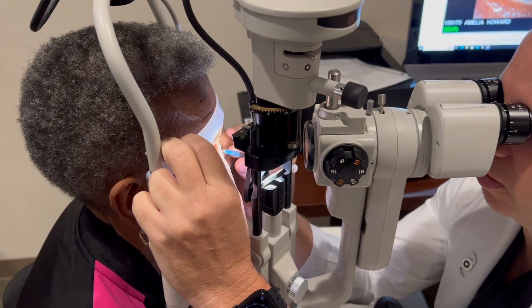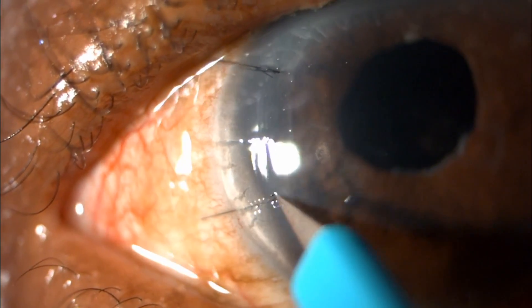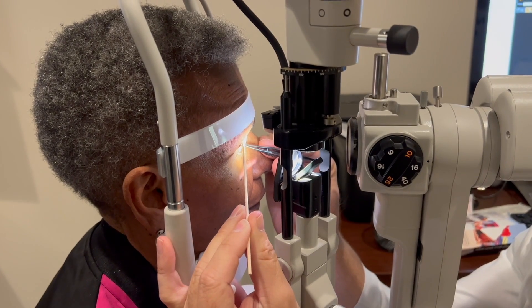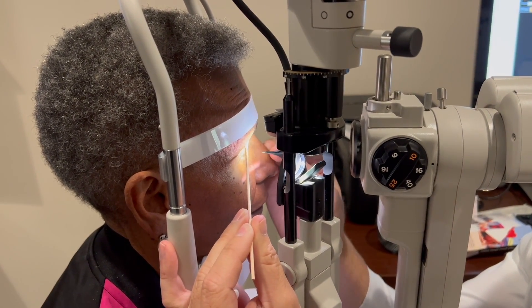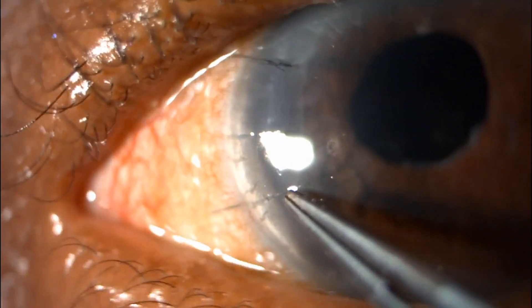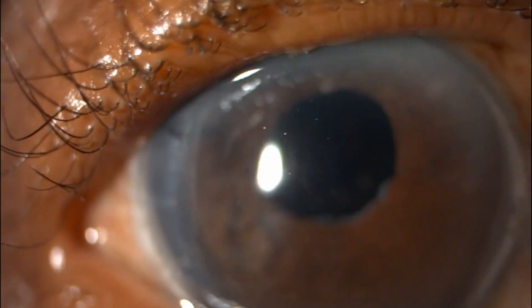Now we'll go back and take another suture out. We'll use the sharp blade once again to nick the suture and then lift it up out of the epithelium. We're going to grab onto the suture and with a quick flick of the wrist remove the suture from the wound. Here you see the entire suture came out including the knot.